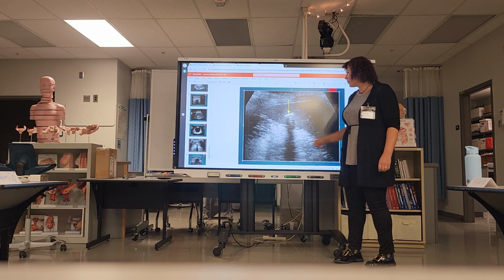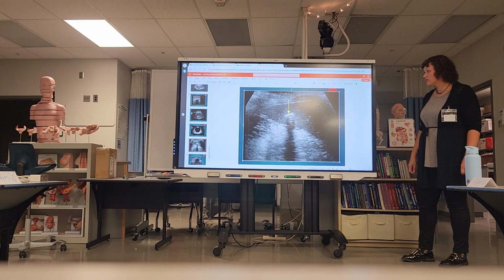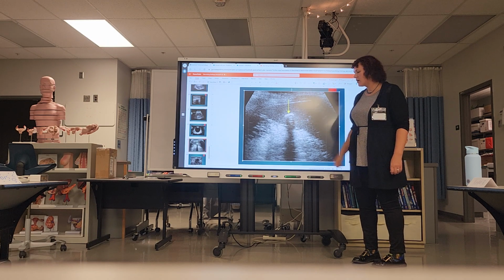Is this a solid or is it cystic? Solid. Solid, yeah. How do we know that it's solid? Shadowing. Shadowing, yeah. Is it calcified? Yes. So this is a calcification. I think this is the liver. This is either liver or spleen, and they've got a random calcification.